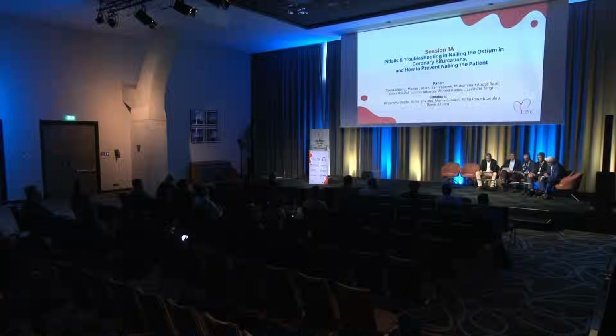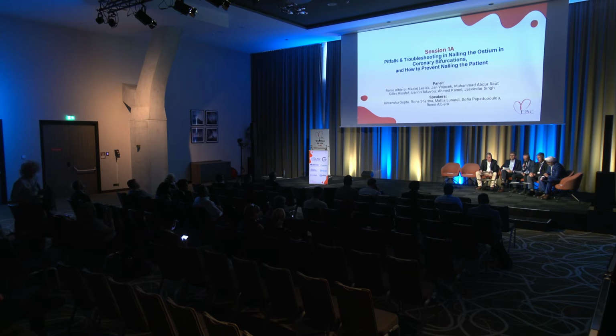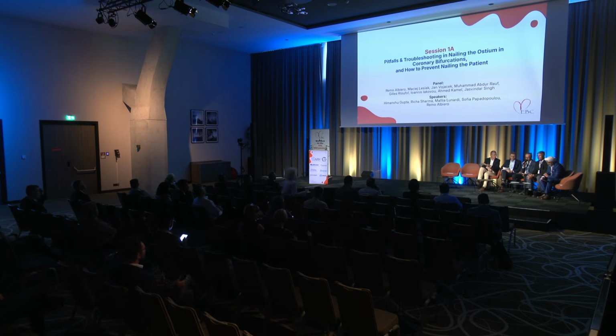So different complication, but the cause was the same. So I decided to give a title to this session: nailing the ostium without nailing the patient. My first presentation is just a summary of how to prevent this complication, and during the cases we will see how to deal with the complication when it occurs, and how you can solve the problem when it occurred. So it's time. We can start with the first one, which is a presentation of a main bifurcation when all doors are closed.